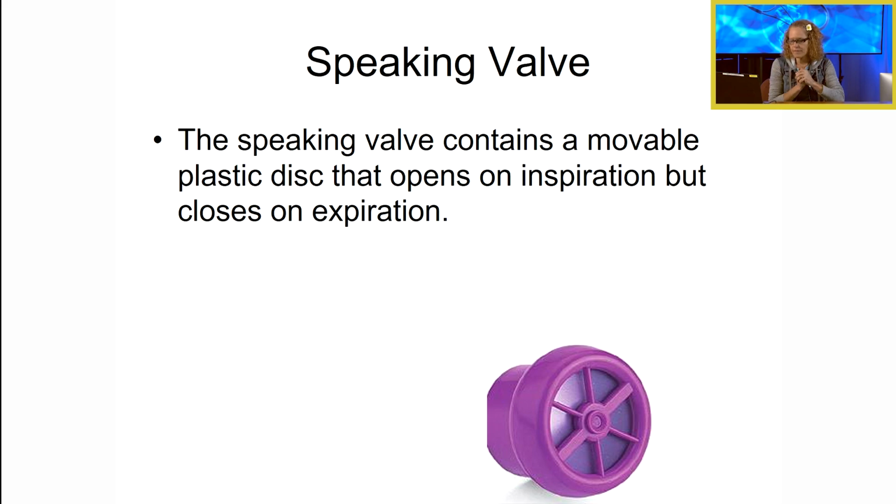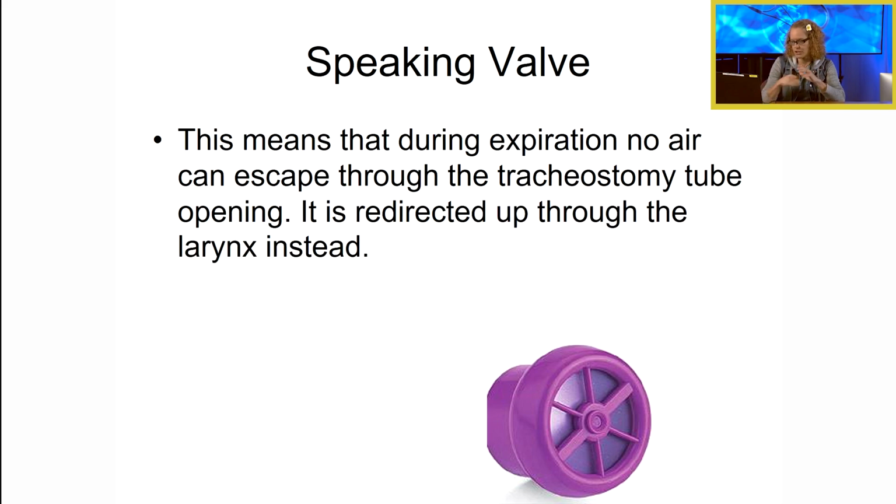So here's a speaking valve up close. It's got a movable plastic disc that opens on inspiration but closes on expiration, okay? This means that during expiration, no air can escape through the tracheostomy tube opening as it is redirected up through the larynx instead.